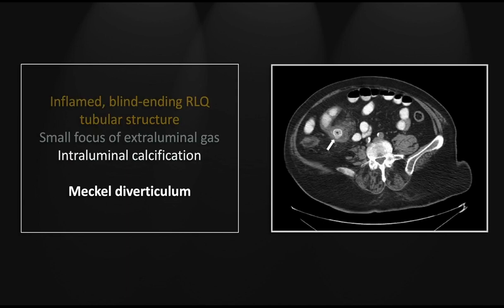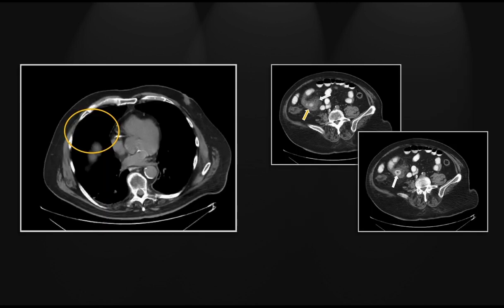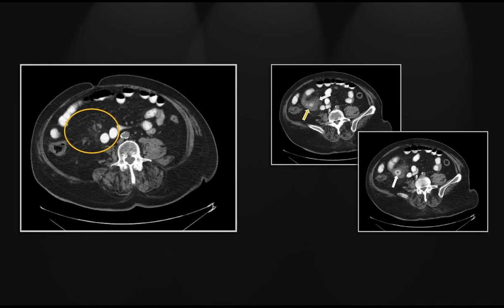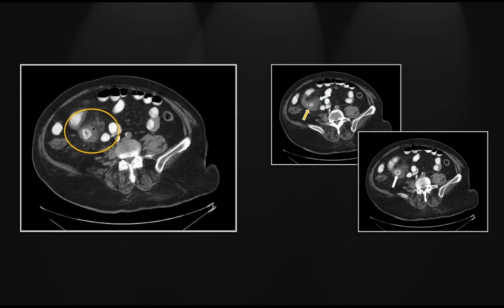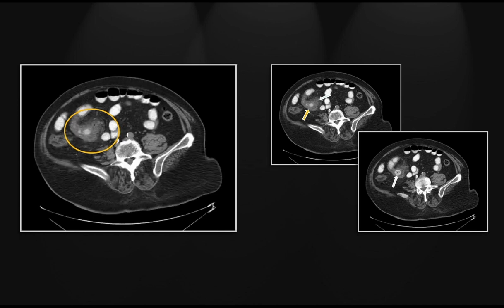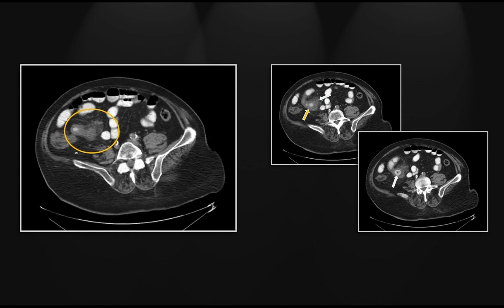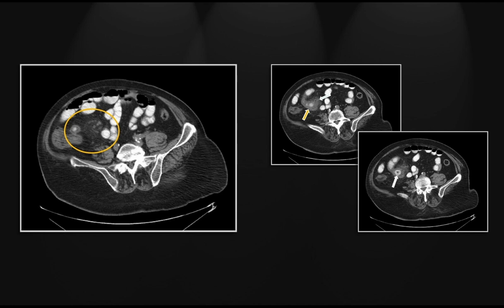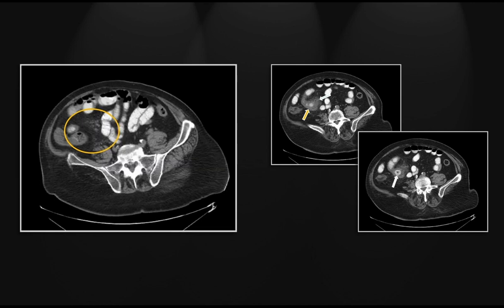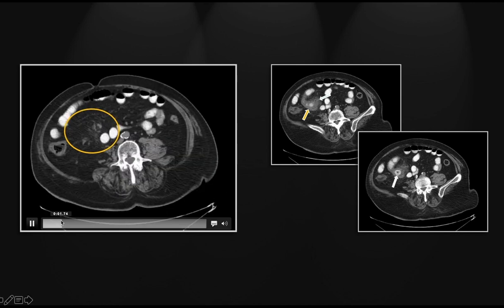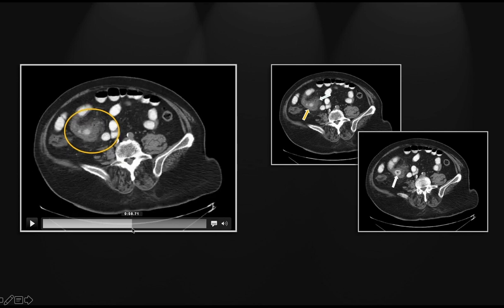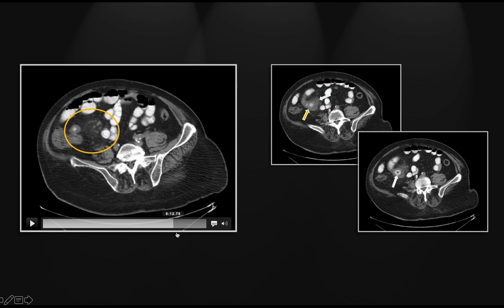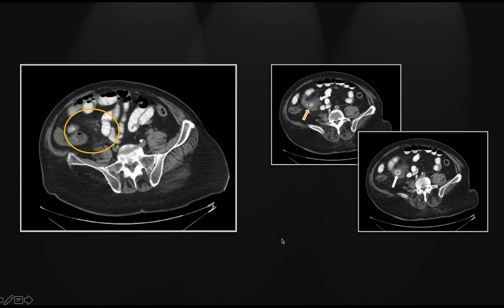On the cine, you can really appreciate that this pouch is blind-ending. Its tip is towards the left aspect and its base towards the right. Right there, you can see a loop of terminal ileum passing immediately past the base of that diverticulum. You see the small bowel passing across its base and continuing on. That is a case of Meckel diverticulum with perforation.